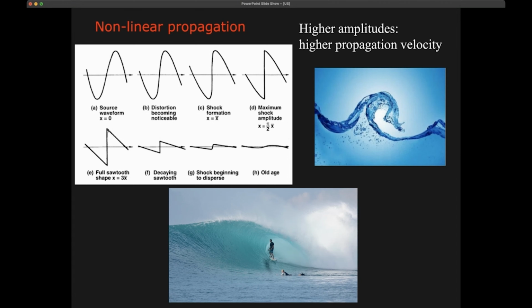And then, of course, once it's triangular, because in tissue, in an object, it cannot roll over like it could at sea, this will go faster and faster. And in the end, it stays triangular, but it actually loses its amplitude totally. So the natural propagation is that a sinusoidal wave will become more and more triangular the deeper you go, and then, because of this nonlinear propagation, will also diminish its amplitude, independent of the attenuation.